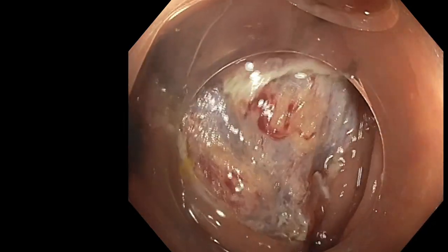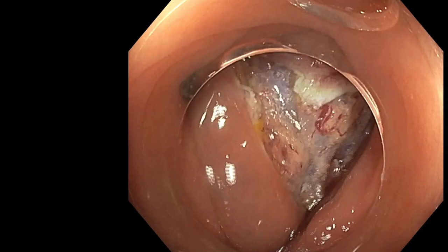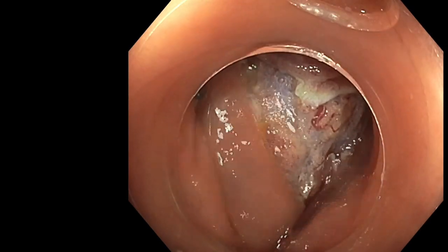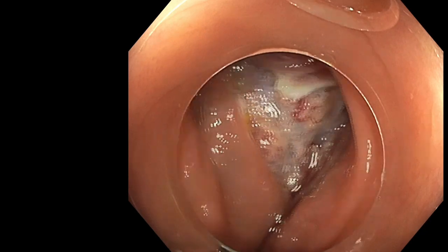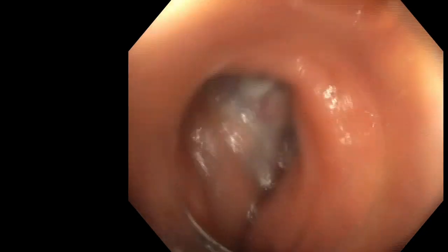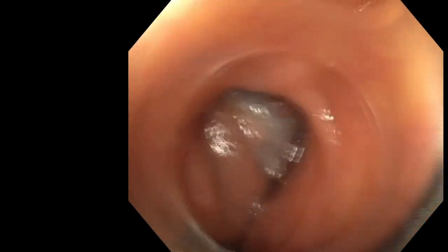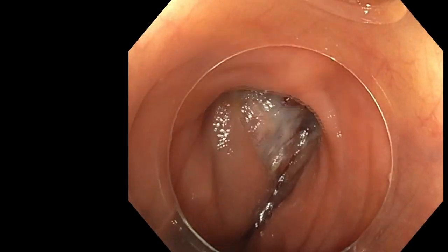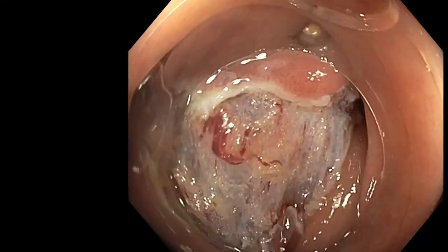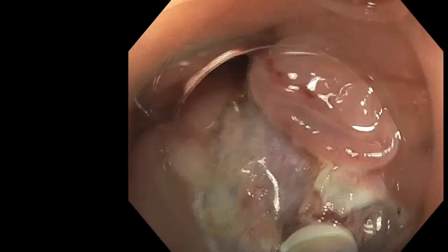And after, thanks to inflation, you are tangential to the submucosal layer and to the area you want to cut. So usually it makes the resection really easier, and in this case it also changed the gravity because all the stool and residue are going into the deepest part.